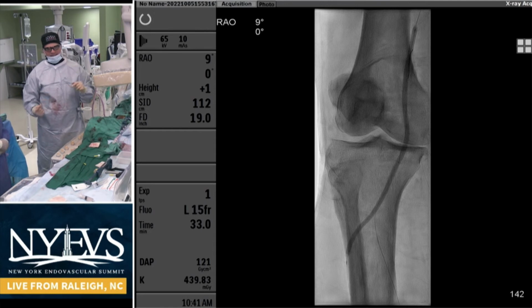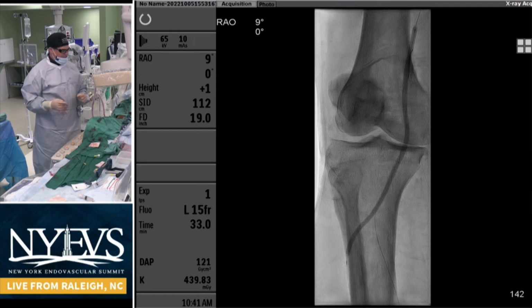The other thing that's important is I've got tibial access and I've got contralateral retrograde. People keep talking about antegrade. Remember, this is an ad hoc case, okay? Unless I would have switched my access after I took the pictures, because you're seeing the pictures just like I am. If I would have done that, then I would have had to go to the other side and switch my whole room. So that's the reason I'm still contralateral retrograde. And it's hurting me in terms of length.